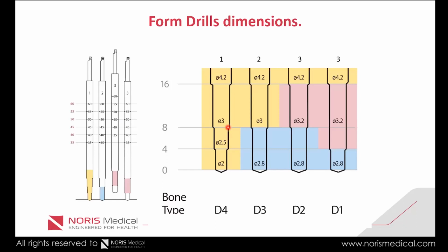of the cases. If we do have some resistance and the implant torque is very high, and we want to increase the drill hole, we'll use drill number two, where actually what we're doing, we're increasing the hole to 2.8 and then to 3 millimeters and then 4.2, okay? And then we put the implant further again.